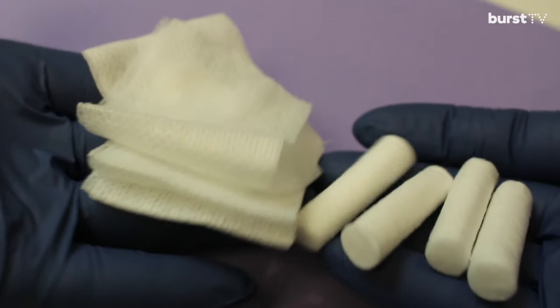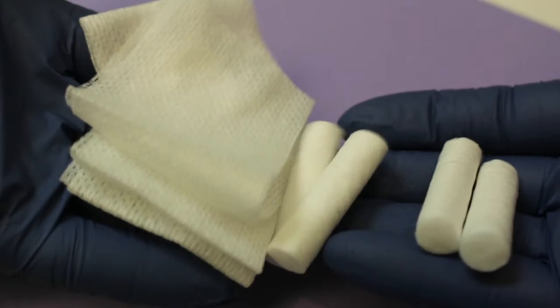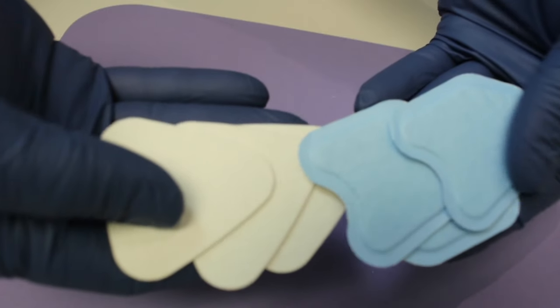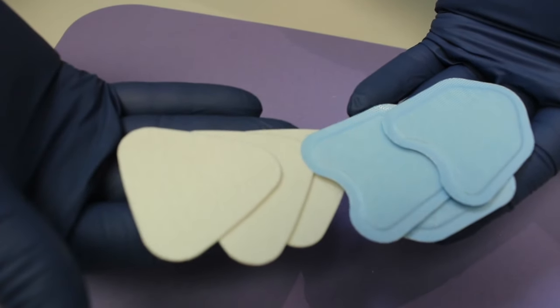Also, for good sealants, like I said, keyword dry, you wanna make sure you have all the drying aids of your choice, because you want nothing to disrupt that sealant. Because if anything disrupts it, such as saliva or water, you'll have to do all the steps again. And it just makes the process a little bit longer. So choose the dry aids of your choice.